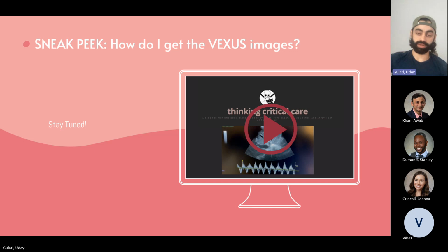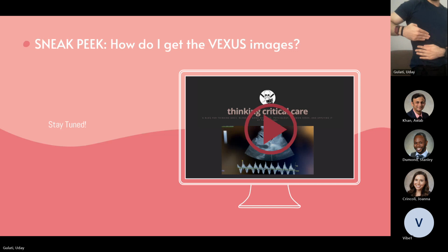The way I would like you guys to remember it is that, I don't know if you guys are able to see, but when you are scanning this way, you find your IVC this way. Majority of the times, if you fan your probe towards the anterior abdomen, you will start to see your portal vein.